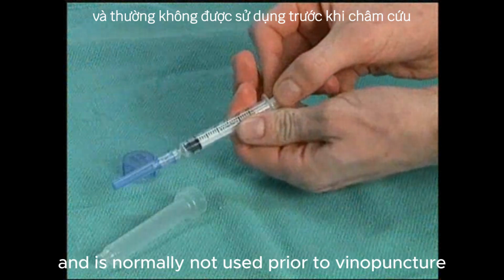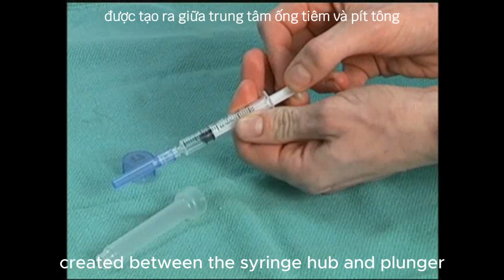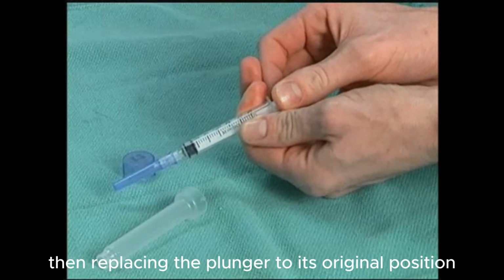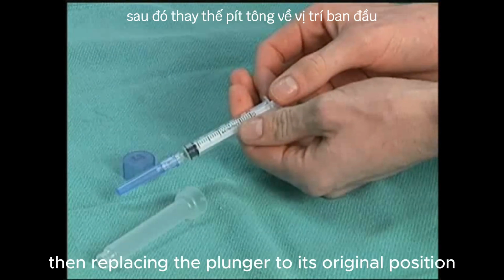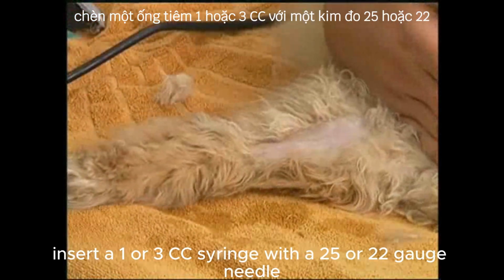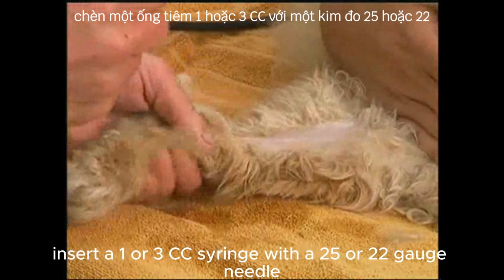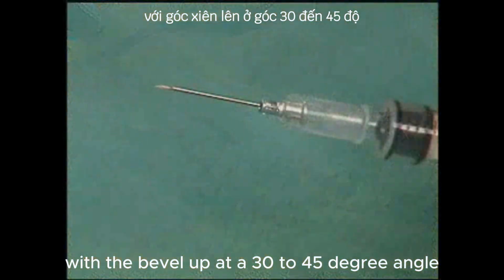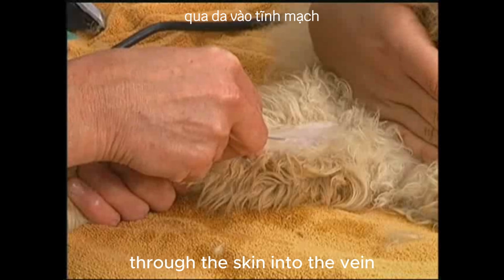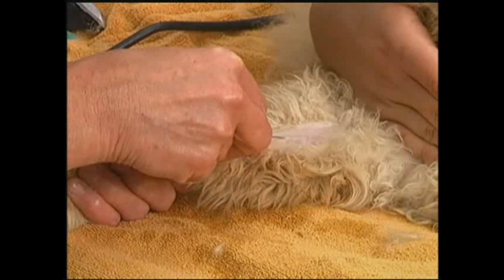Prior to venipuncture, break the suction seal created between the syringe hub and plunger by gently pulling back on the plunger, then replacing the plunger to its original position. Insert a 1 or 3 cc syringe with a 25 or 22 gauge needle with the bevel up at a 30 to 45 degree angle through the skin into the vein as shown here.